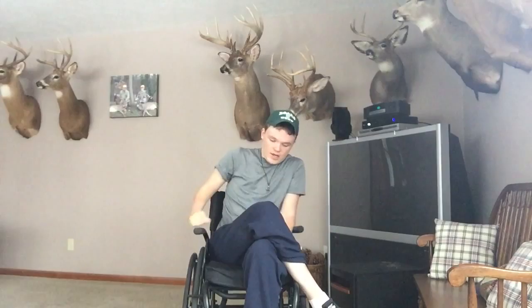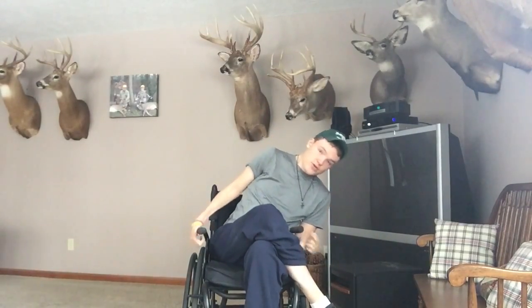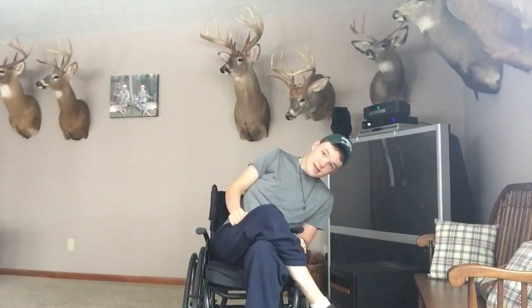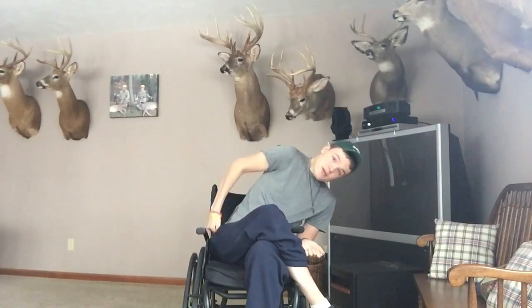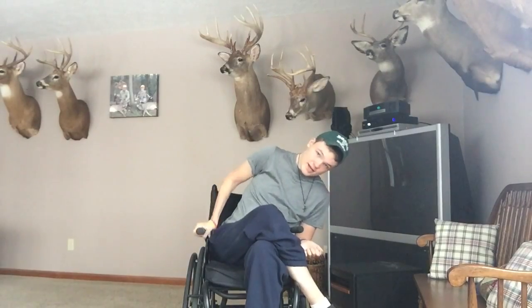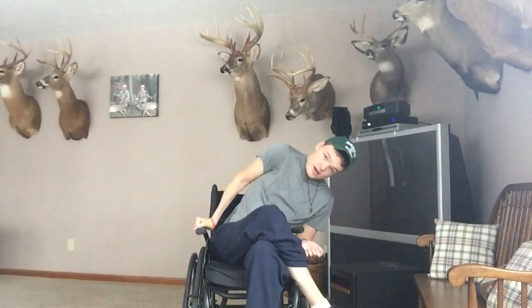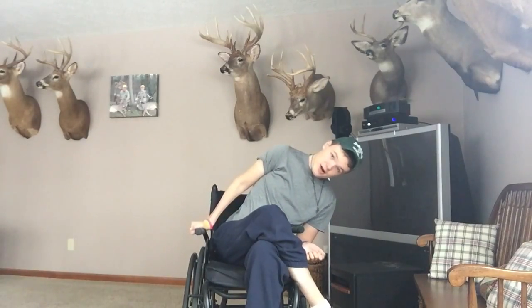And basically what you want is the bend of one leg kind of on top of the knee of the other one, and lean over to where that leg is pointing. So this will relieve pressure from my right butt cheek, and I can kind of push on this here, or this handle back here, to try and get more pressure off.